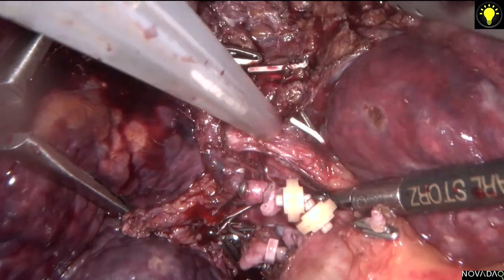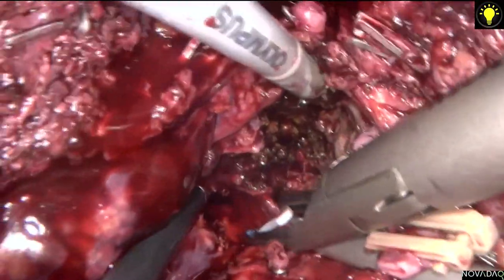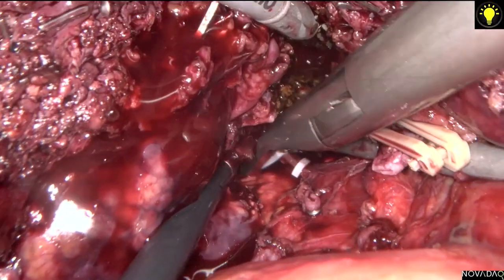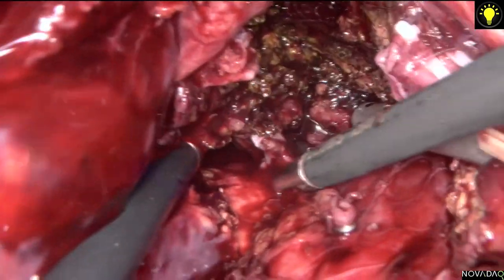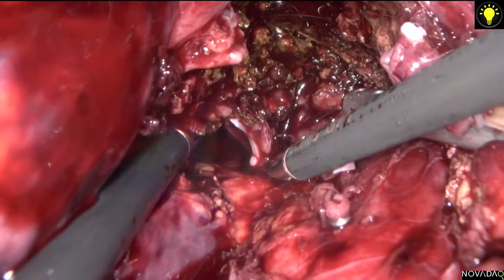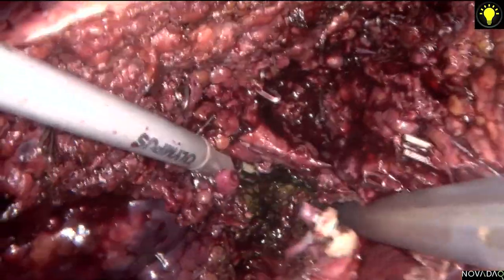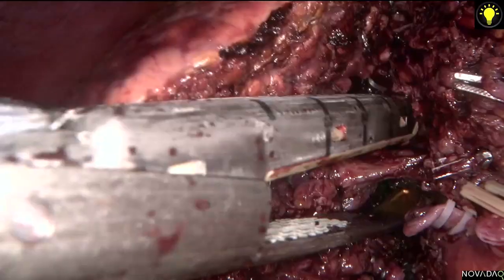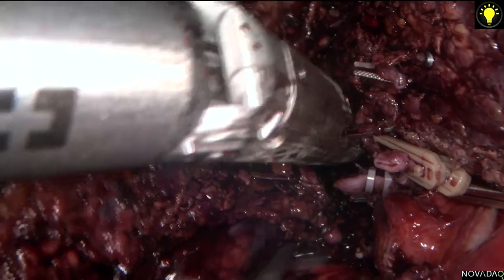Indocyanine green immunofluorescence technique may be a good method to supplement detection of tumor in patients with HCC and cirrhosis. After careful dissection of the liver parenchyma, the inferior vena cava is fully exposed. The inferior right hepatic vein is controlled and divided. With further dissection through the liver parenchyma with CUSA, we can see the right bile duct, which can be controlled and divided by a vascular stapler.